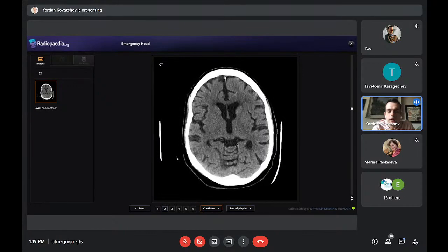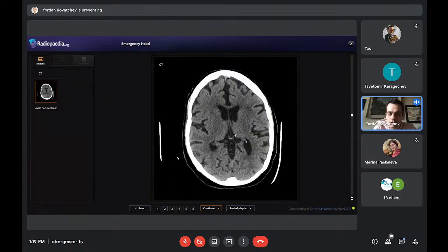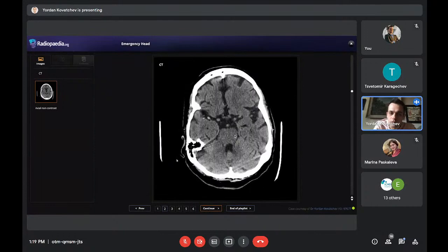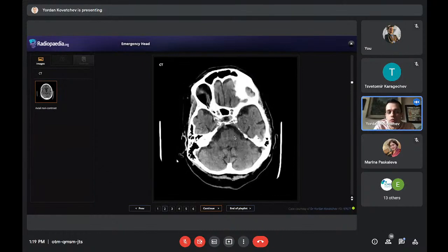let's look carefully. And by the way, you can unmute your microphones, whoever's still watching, if you want to give a suggestion. If you're looking at yourself, think about the things we talked about today, especially the take-home messages. I understand that you can't remember everything. It's absolutely normal. It took us a lot of time.